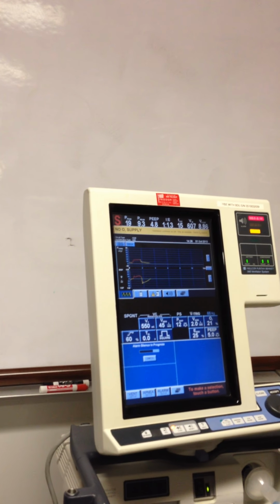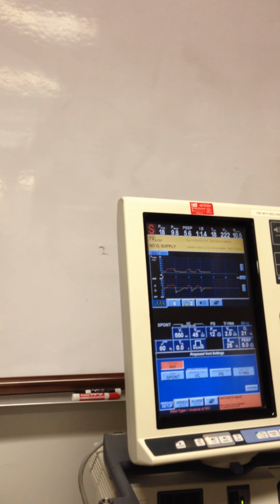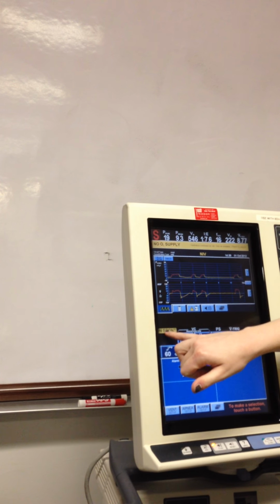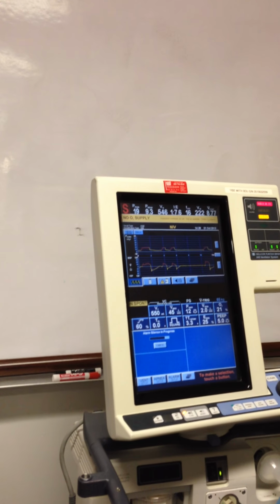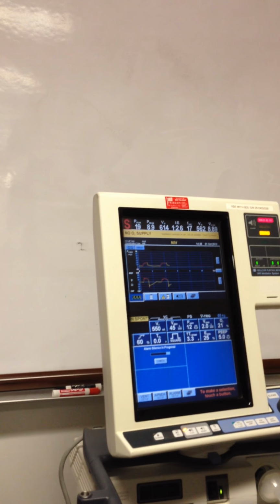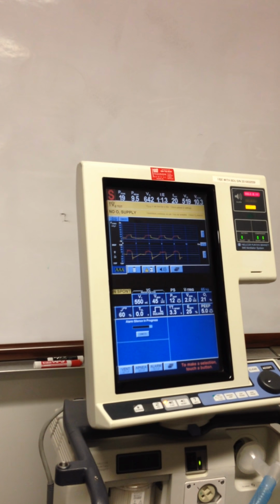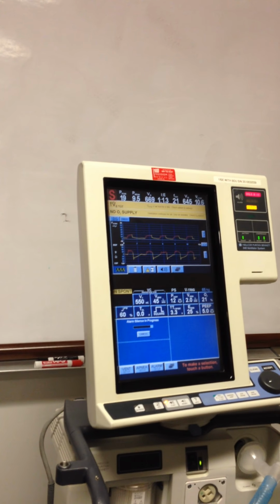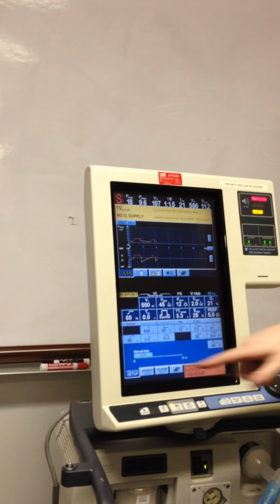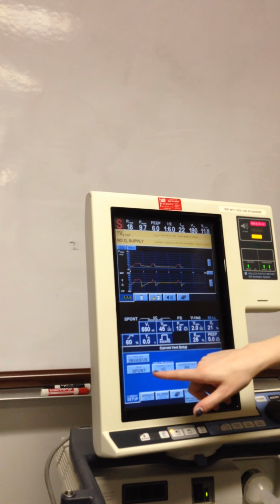All right. That's non-invasive. Once you put somebody in it and spontaneous shows up in yellow, and right here in yellow, that's really your only clue, other than the fact that your patient has a mask on and not an ET tube. And again, if you wanted to go back, this is going to take us back to our previous settings then, right?